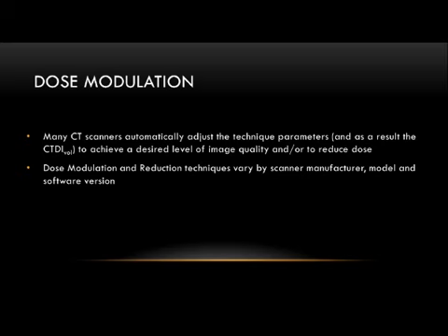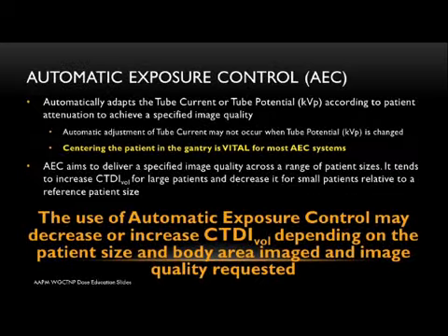And what's really important to remember is that the implementation of these systems varies dramatically from vendor to vendor, and it can even vary from software version to software version in the same vendor. So that's very important to remember. What applies on your Siemens system may not apply to your Philips system, and what's on your GE might not apply to your Siemens. So very important to remember, especially if you're in a practice with multiple types of scanners.